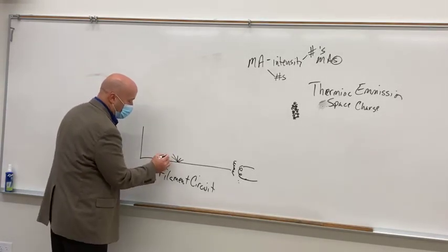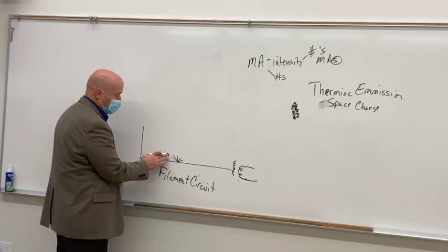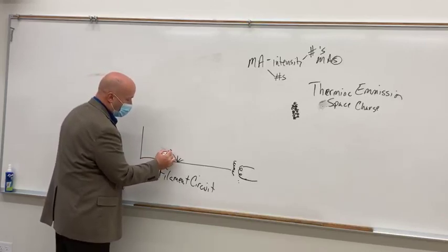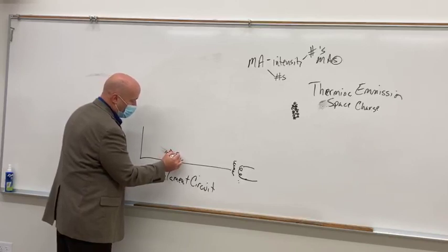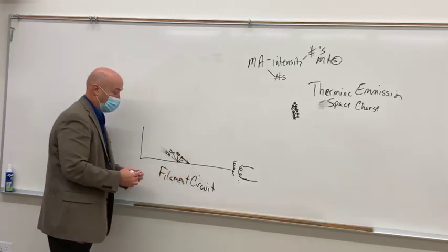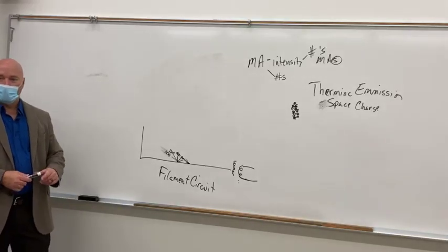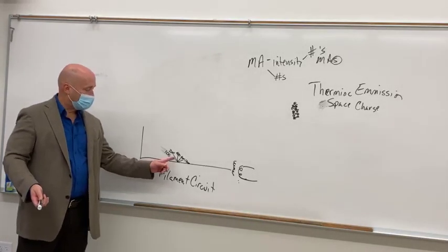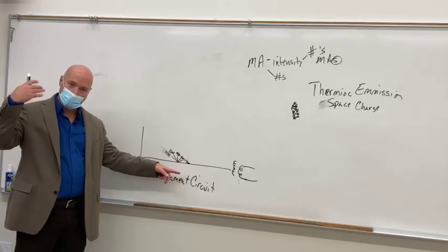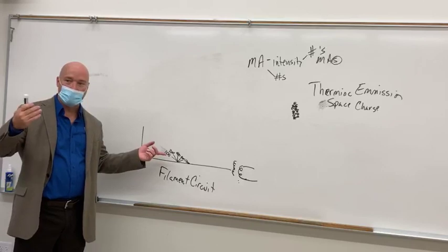So your MA selector may go from, I don't know, I've worked on systems where you could select as low as 10 MA. You don't see those a whole lot. So, you know, maybe select 100 MA, 200 MA, 400 MA, 600, and 1200 MA. Okay? So, what are you doing there? You're choosing, right? So if you go from 400 to 1200, you turn it up, and if you go from 400 to 100, you turn it down.